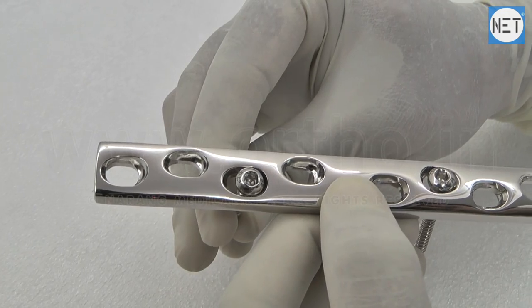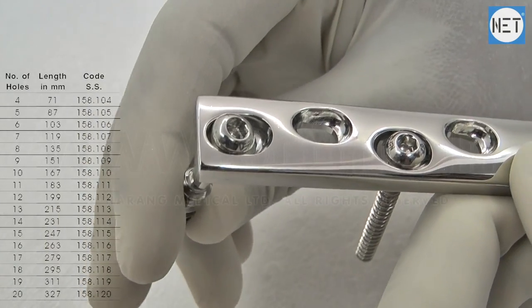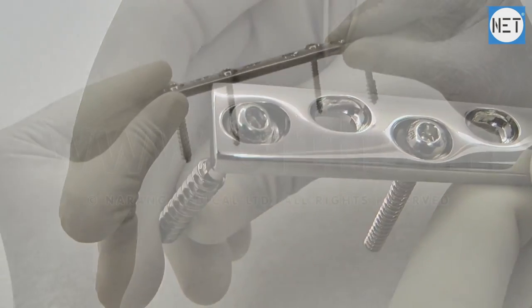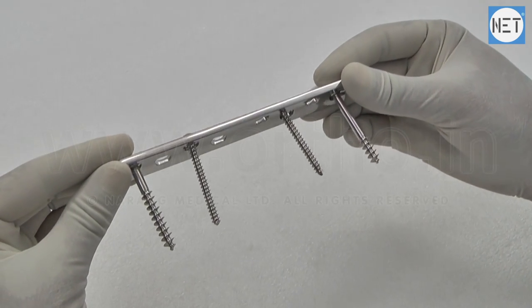These plates are available with a number of holes varying from 4 to 20 and in lengths varying from 71 to 327 mm. Net Brand Broad Dynamic Compression Plates are available in stainless steel and titanium.